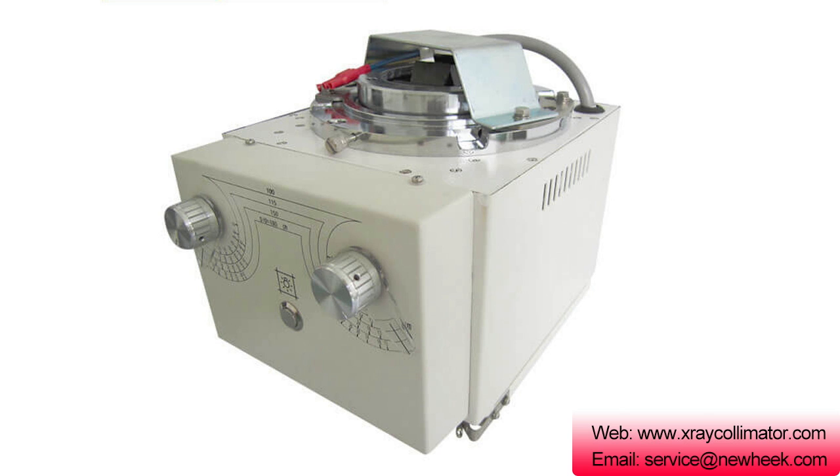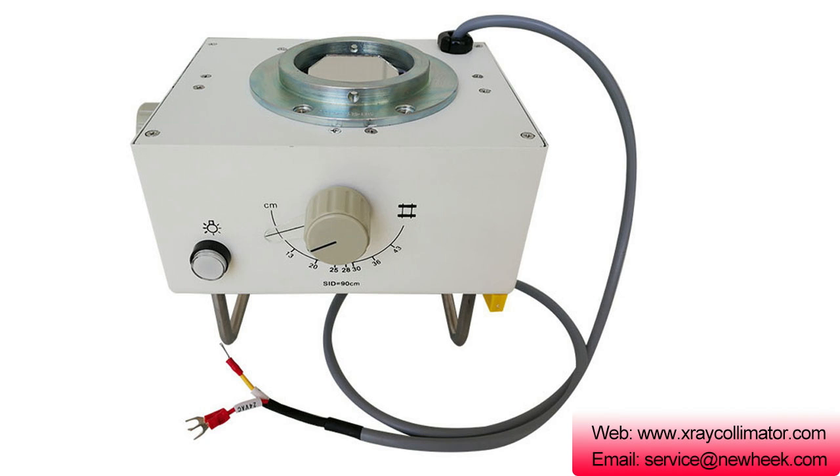NK-102 Collimator. Application: it can be used on a normal radiography X-ray machine. Technical parameters: max irradiation field 440 mm x 440 mm at SID 100 cm. Light field average luminance: 160 lux, illumination ratio 3:1.